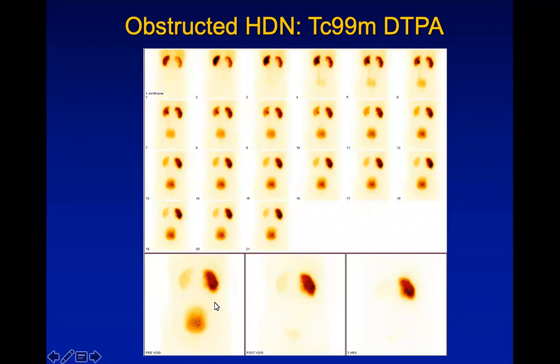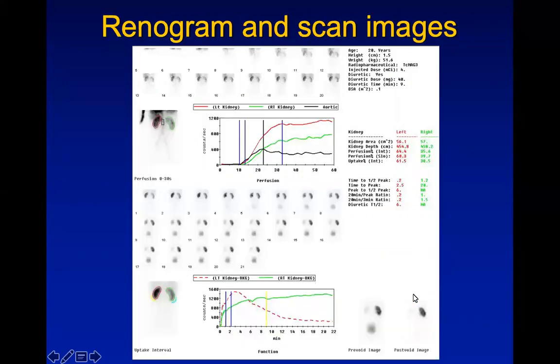Now out here, the other kidney is functioning, so the bladder has filled up. So the patient goes and voids. And once the patient comes back, this is the empty bladder 5 minutes later. This kidney still shows holdup of tracer. And at 3 hours, there is continued holdup of tracer. So here you have a hydronephrosis, normal in size, with fairly preserved function. It's mildly impaired, I would say. It's not normal. It's not a totally gone kidney. And continuous accumulation, so PUJ obstruction.